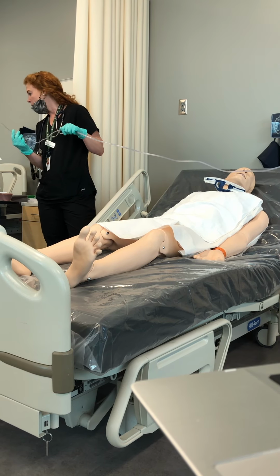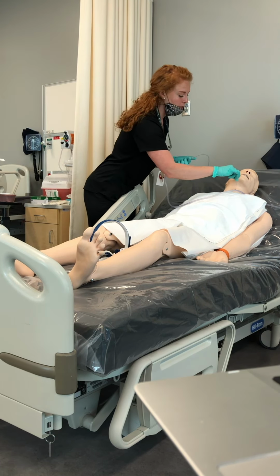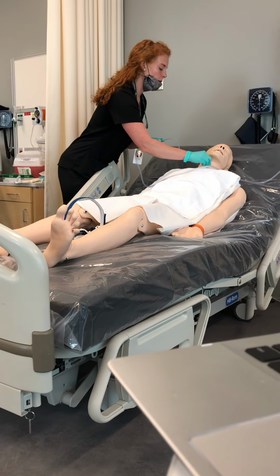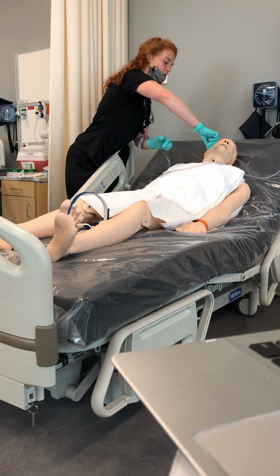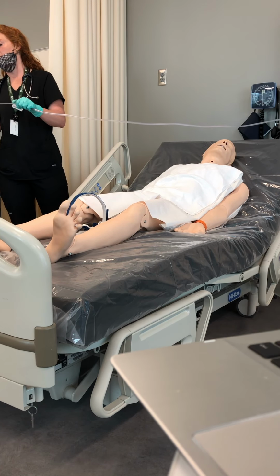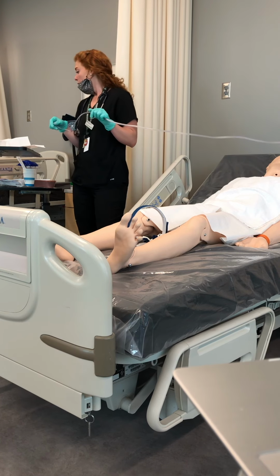Rotate and withdraw the catheter. And then you'll rinse the catheter with the normal saline and repeat. So when you're going in, you're going to advance. Again, I don't think that you're going to get that far with this. Oh, all right, okay. So go as far as you can until you meet resistance. And then as you're pulling out, you're going to rotate and intermittently apply suction as you're withdrawing the catheter. Then it will come out, and you will rinse again, get all that gunk out of there with that sterile saline, and then repeat however many times you need to. You're only going to need to do it once for your test out.